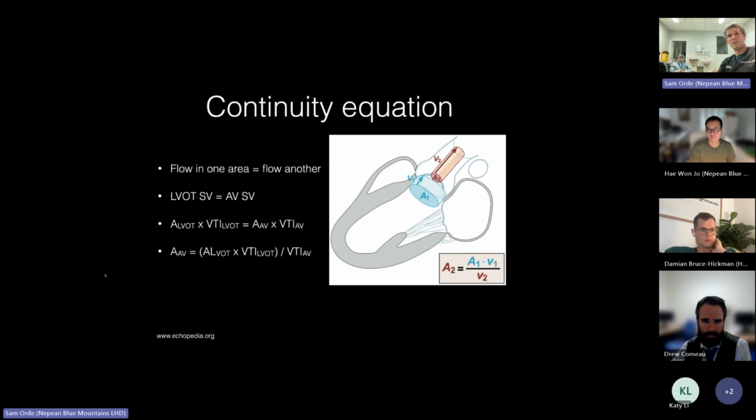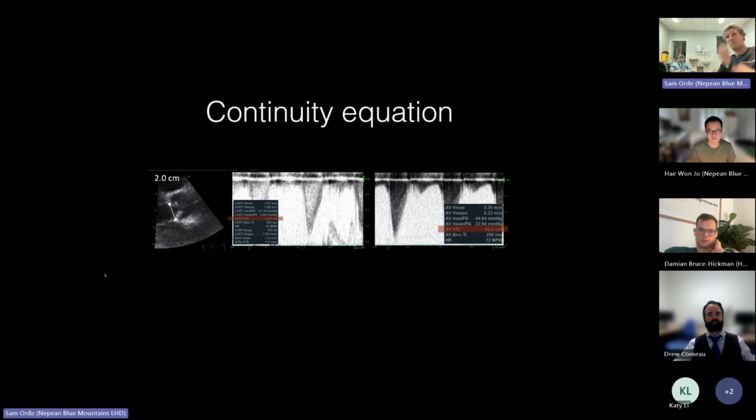And of course, it's a really valuable part of trying to assess aortic stenosis, and you can compare the DSI between the two. The reason you need to measure this and not just use a single measurement for an aortic valve is this: we know a mean gradient greater than 20 is a mild to moderate stenotic valve.